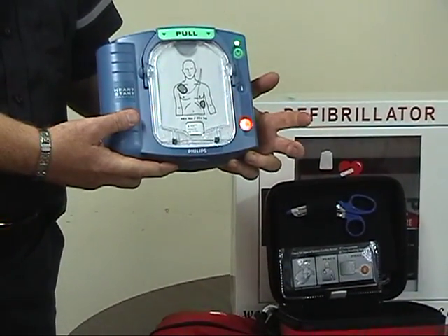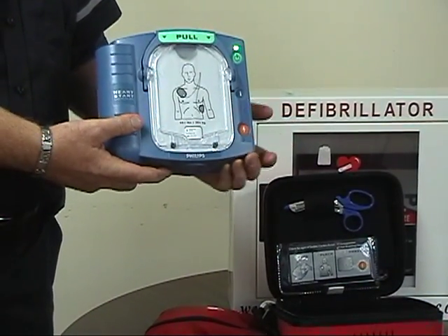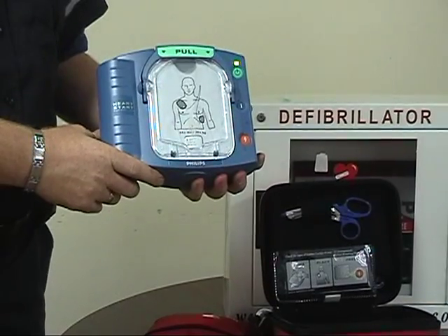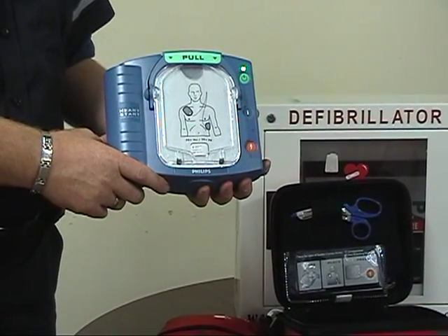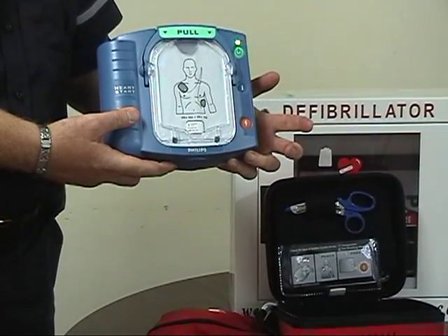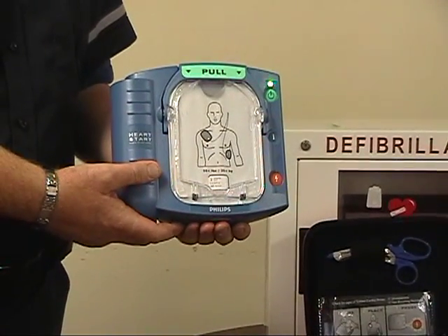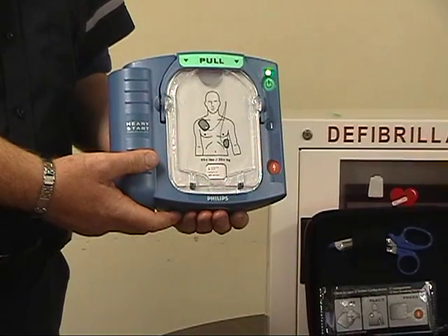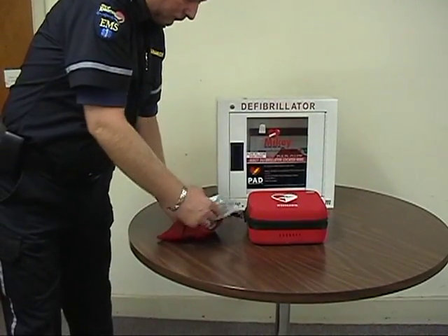The device will coach you to push the orange button — do as it directs and then let it go through a two-minute test. Upon completion of the test, it will shut itself off and confirm it's ready to go again. The device audio prompts will say: 'Self-test. In case of emergency, press the green on-off button. Verified. Testing ready for use. In case of emergency, press the green on-off button.'